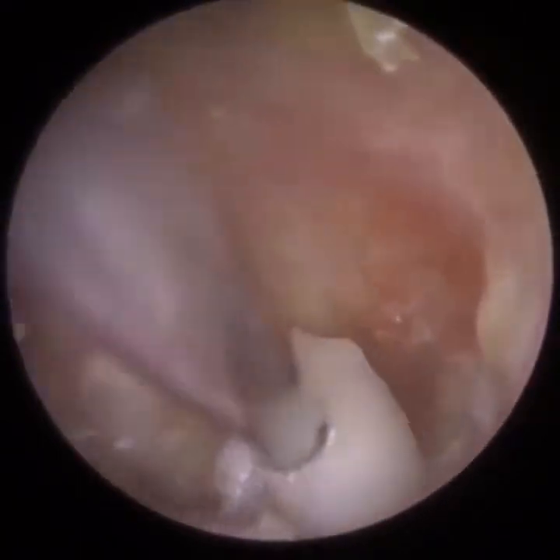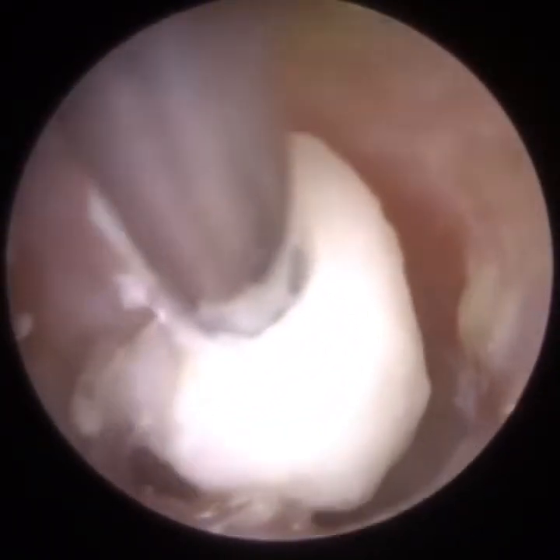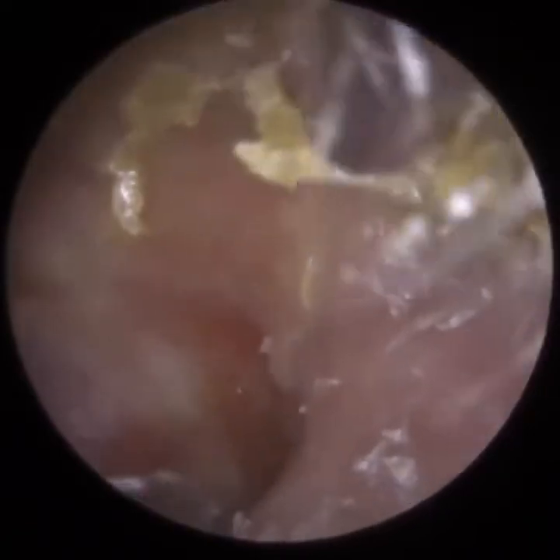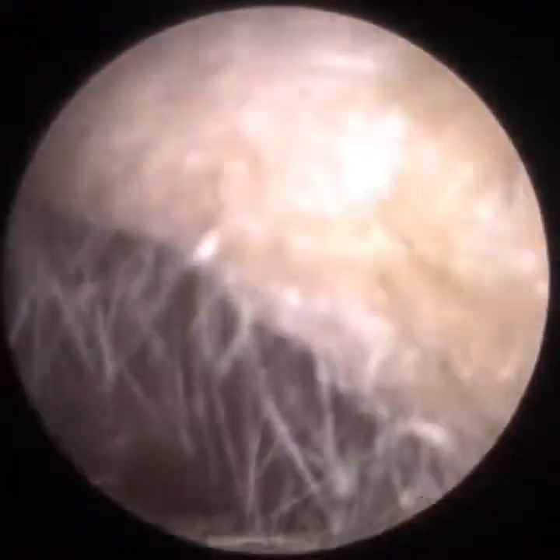There we are. And I bet you weren't expecting that when I was peeling it slowly away. Neither was I. Again, just put the fine end gauge back on. I'm just going to try to peel some of the skin. The skin's less crusted, it's stickier and gooier. Remember the right ear, it's a lot more solid.